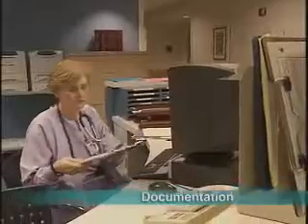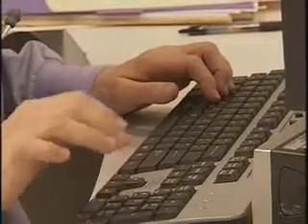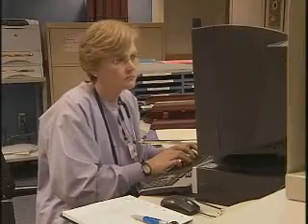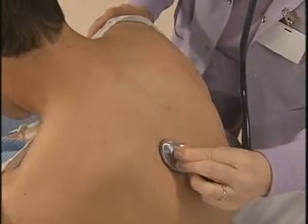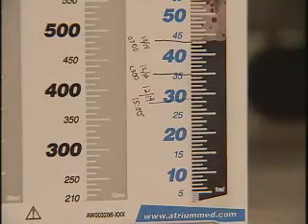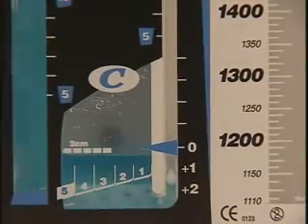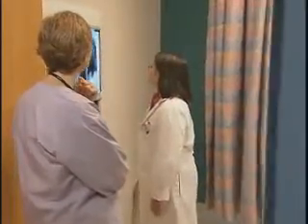To help determine the effectiveness of the chest tube and drainage system, thoroughly document your assessment findings. For a patient whose pneumothorax is resolving, expect to record normal, easy respirations without dyspnea, symmetrical breath sounds that reach the periphery of the lungs, including both apices and bases, reduced drainage in the collection chamber, little or no tidaling in the water seal chamber as a sign of lung reinflation, and a chest X-ray that shows resolution of the pneumothorax.